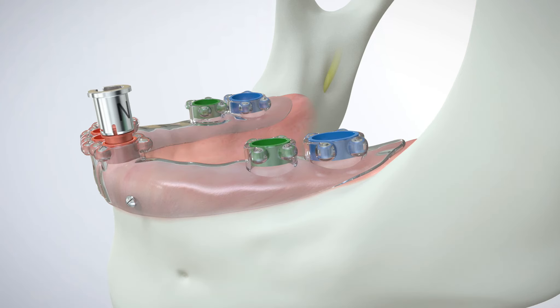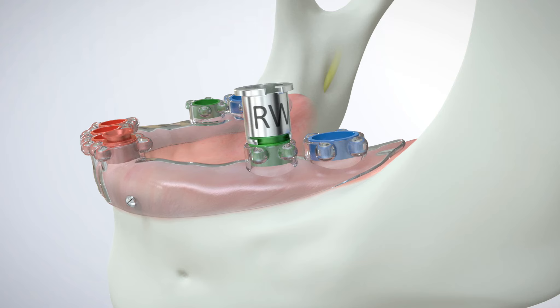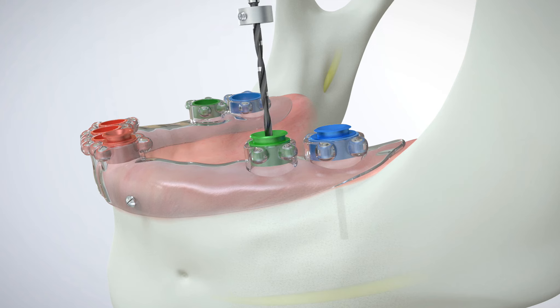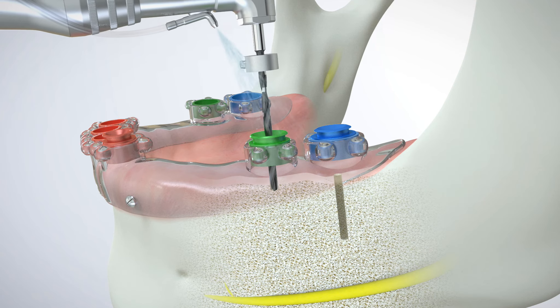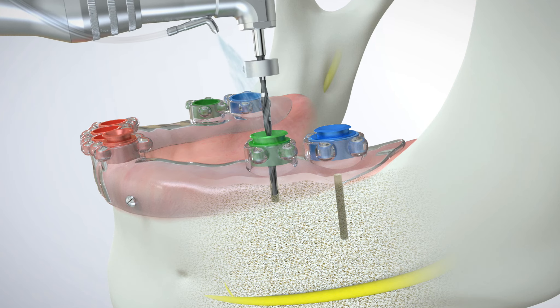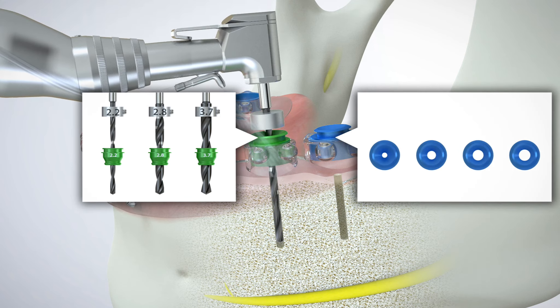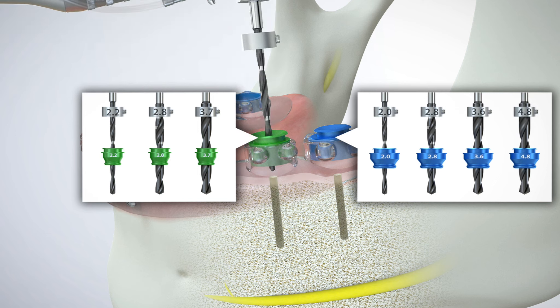The drill sleeves are then snapped into the surgical guide, and the IR tools simply separate from the drill sleeves using a sliding motion. Color coding and numbering of GRS drill sleeves and drill stops provide simple visual recognition for different drill sleeve locations, drill diameters, and complete drilling sequences.